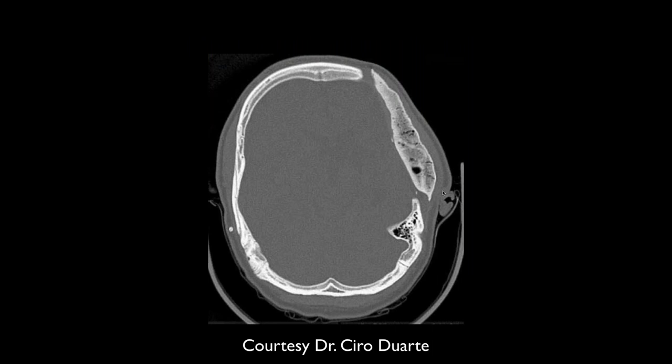I think this is, well, it looks post-operative, first of all, but the bone flap looks like it has fibrous dysplasia in it. That's not bone. Yeah. Fake bone.